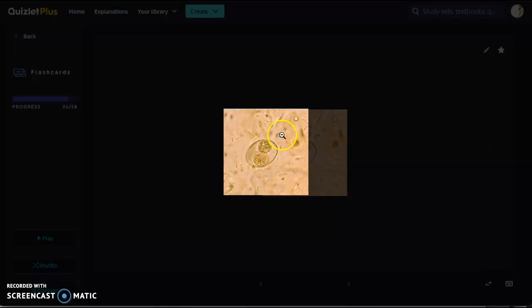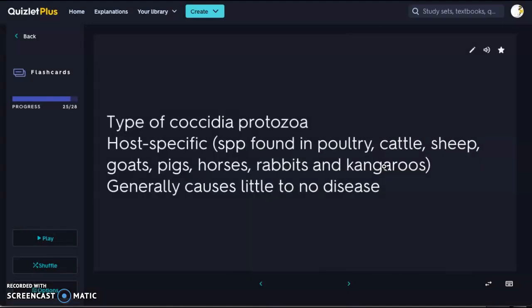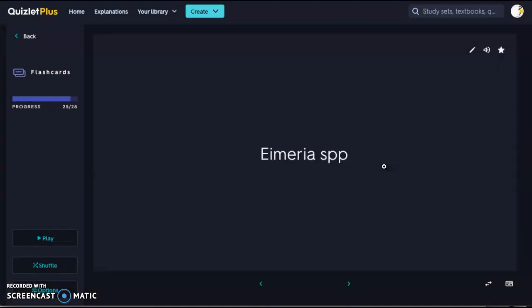Here is our Isospora protozoa — not to be confused with an ova. This is a single-celled organism. We have an outer line with two circles in the center. That is your Isospora protozoa.